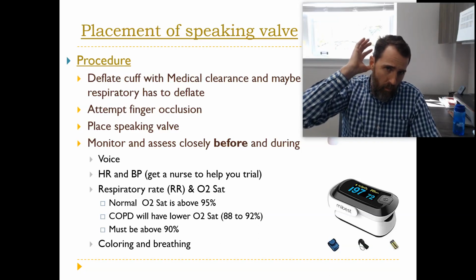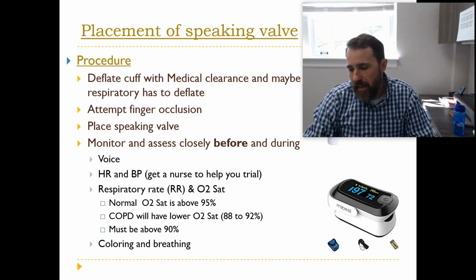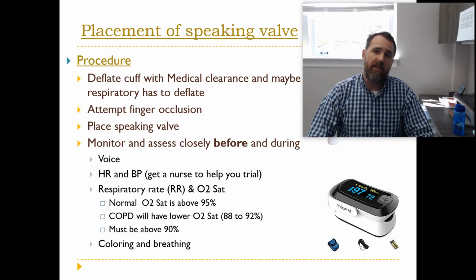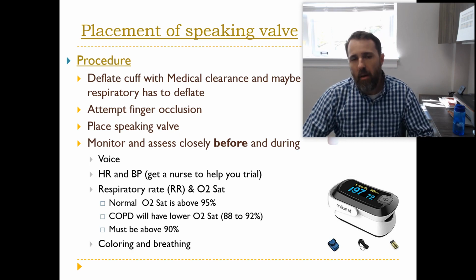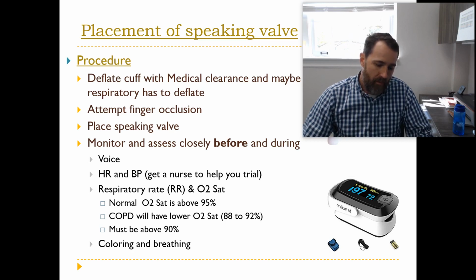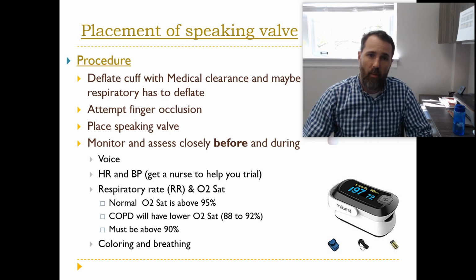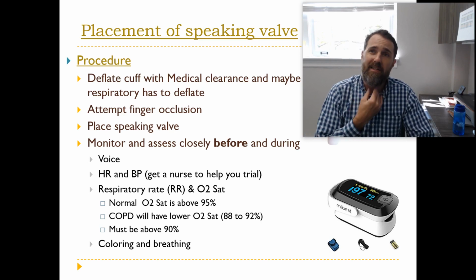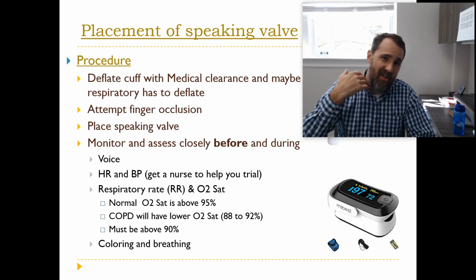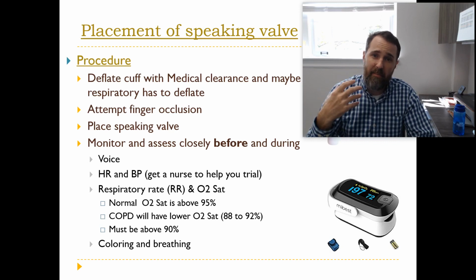All right, so placing the speaking valve and working with the patient on getting established on their speaking valve is something that, as the speech therapist, as the SLP, we do a lot. First, you would want to deflate the cuff. And like I said before, you always want to do that with medical clearance. And I would say you always want to have a nurse there for possibly if they could go in and try to suction out anything that might be resting on top of the cuff, that would be a benefit.